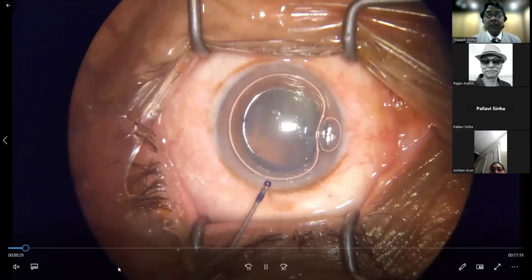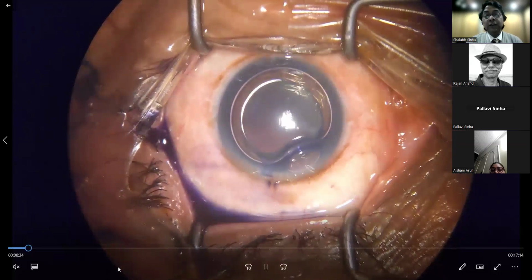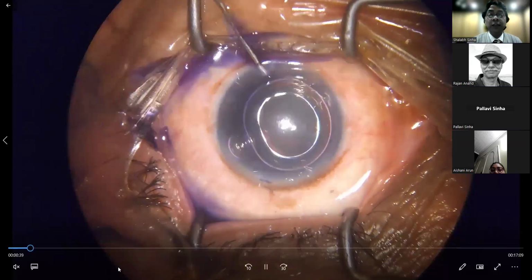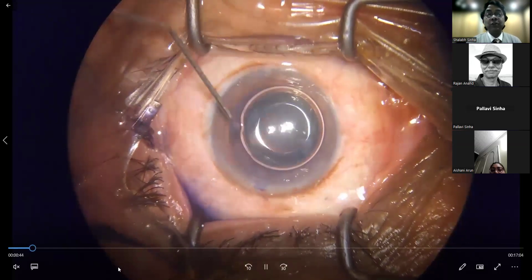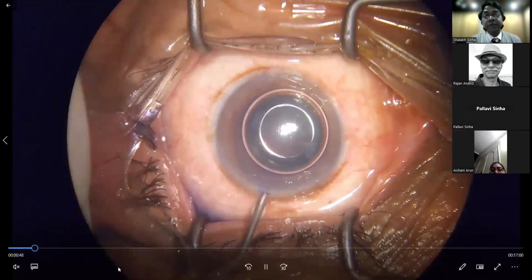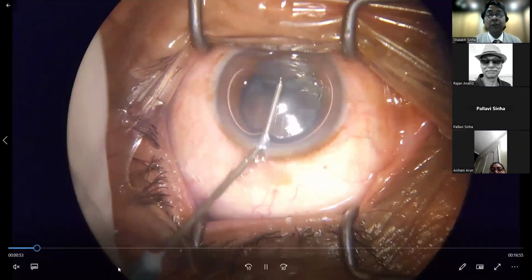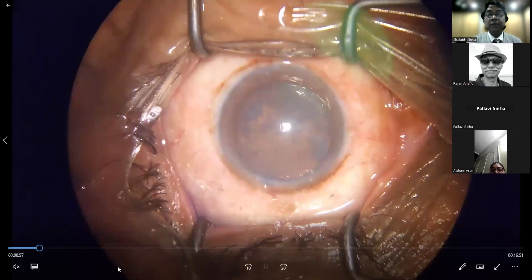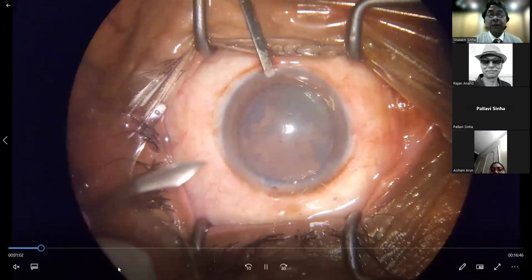Air is placed inside the anterior chamber, followed by trypan blue. I usually do this to protect the corneal endothelium. Air is always injected and washed through the other side port so that some of the trypan blue also stains the side port, and one doesn't have to look for it when one introduces the chopper with the left hand. Then followed by dispersive viscoelastic.